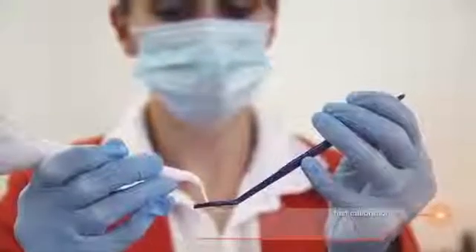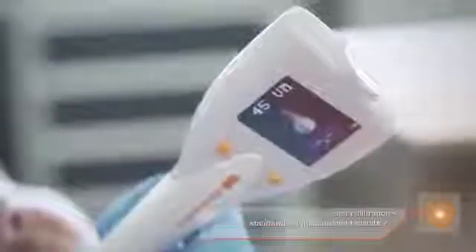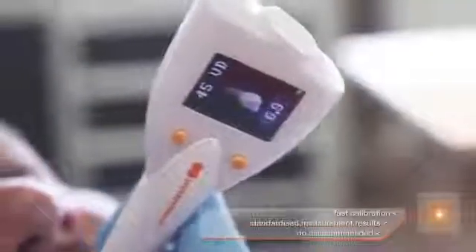Put on the hygienic measuring tip, calibrate it, and ready to go. While you are recording, the probe gives you optic and acoustic feedback. You don't need an assistant to document the measuring results because the probe memorizes everything. After measuring, you just put it into the docking station.